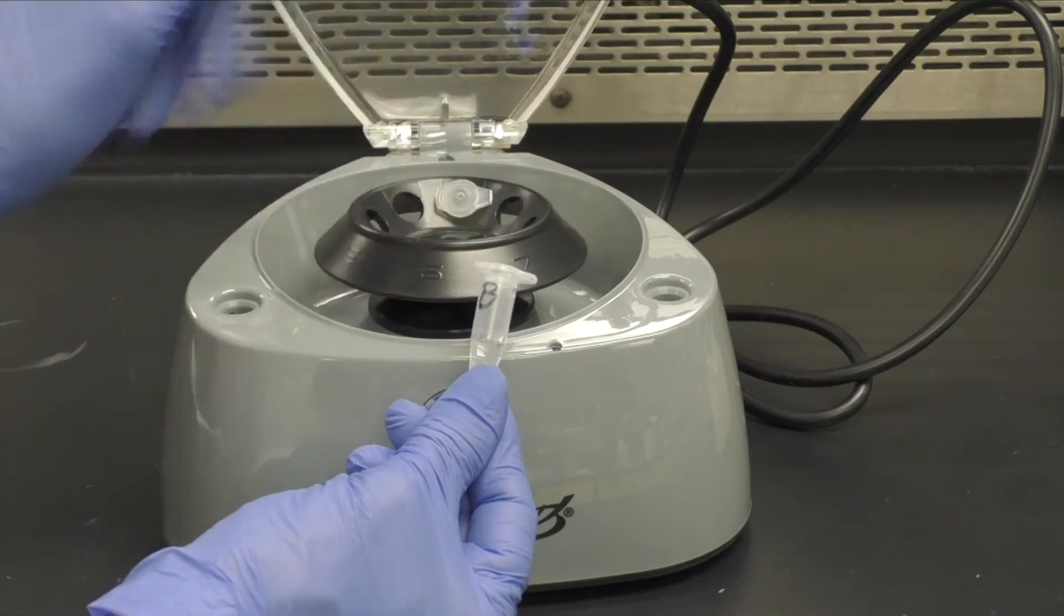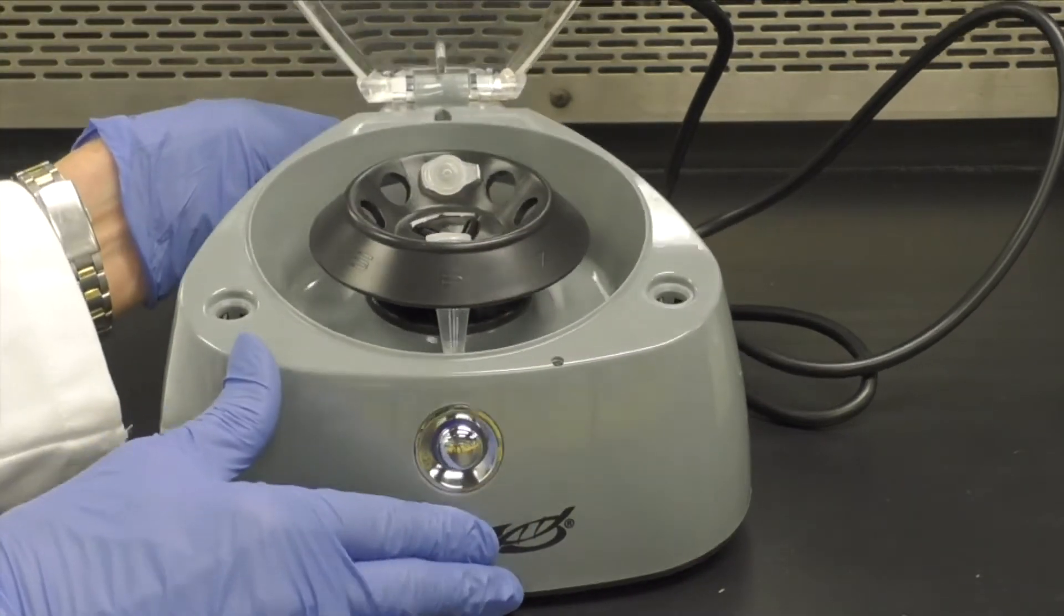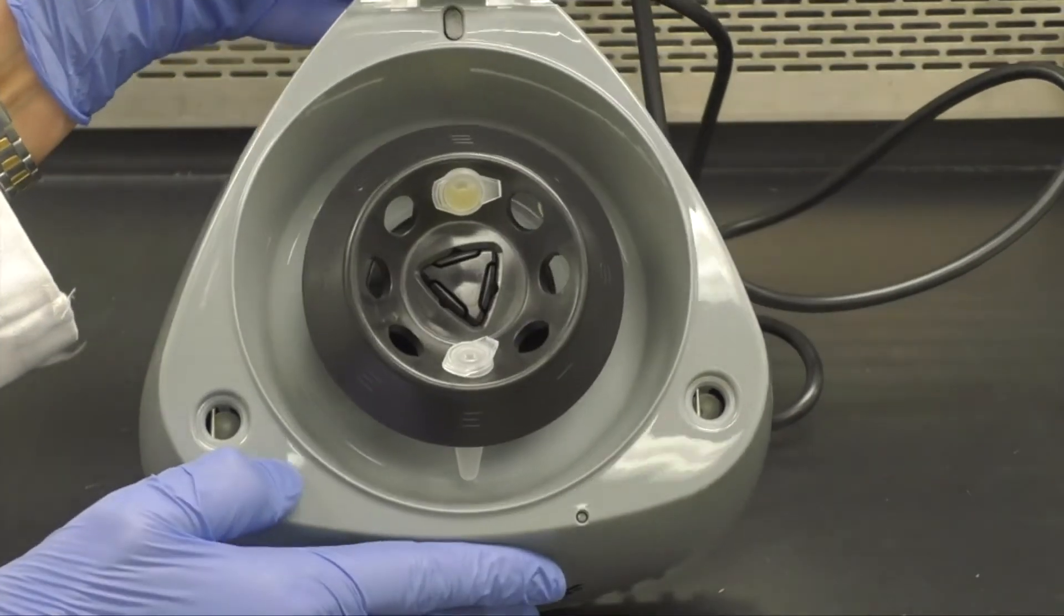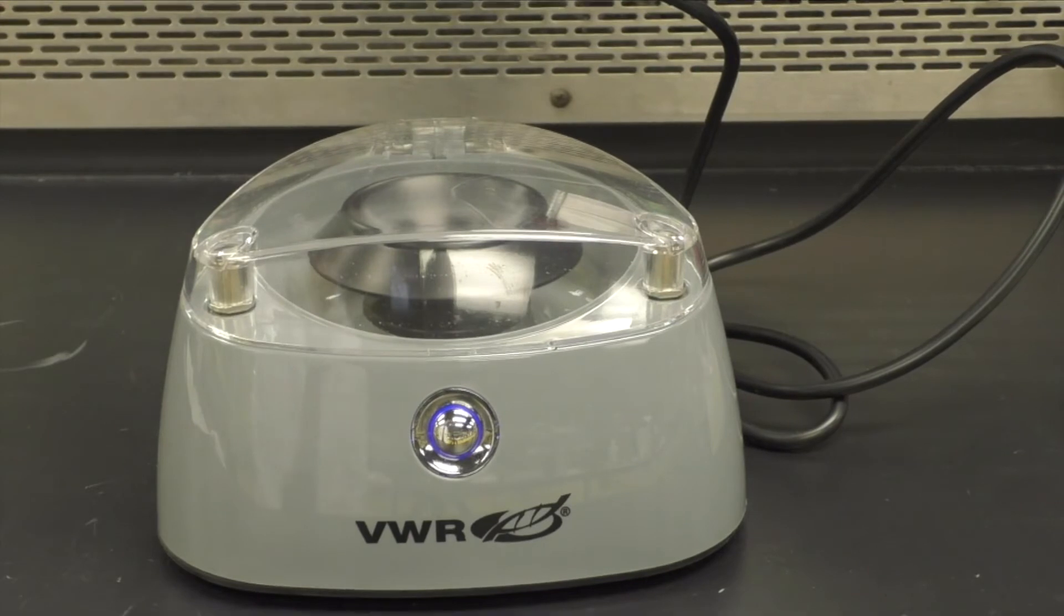When the 5 minutes is up, insert your patient sample and place the balance tube directly across from it as shown here. To start the centrifuge, just press down on the clear plastic cover.